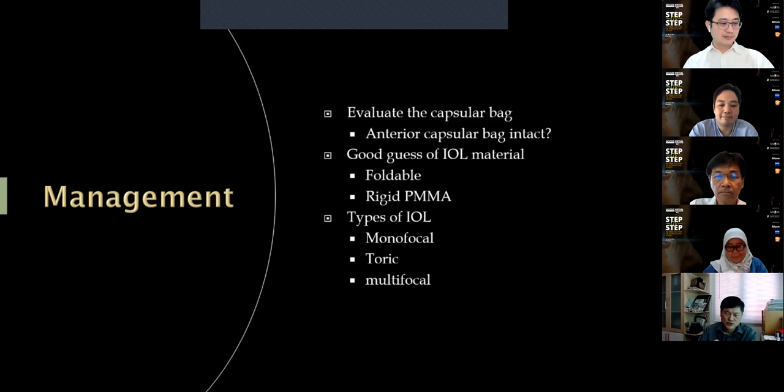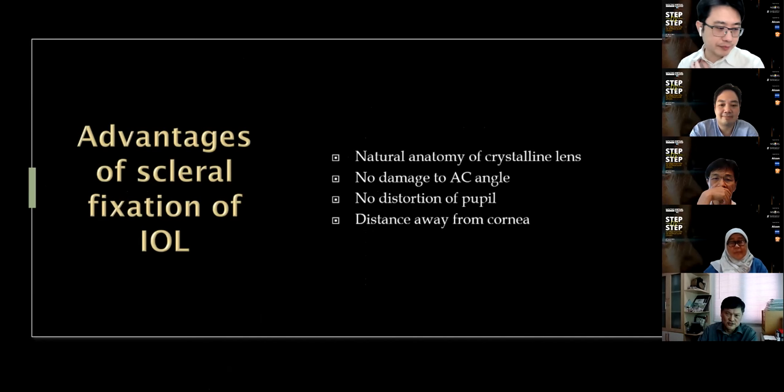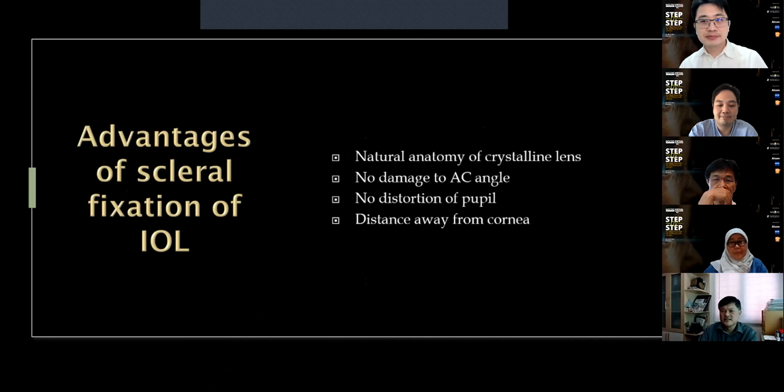So that the patient will have the same kind of refractive outcome after the surgery. Now, the advantages of a scleral fixation of IOL: it rests at the natural anatomy of the crystalline lens. It doesn't cause any damage to the anterior chamber angle. It doesn't cause distortion of the pupil. And again, it's distant away from the cornea, so it has less chance of causing any corneal endothelial cell damage in the long run.